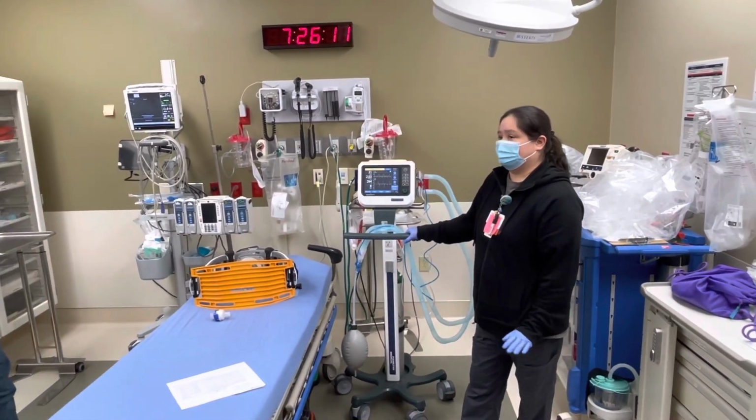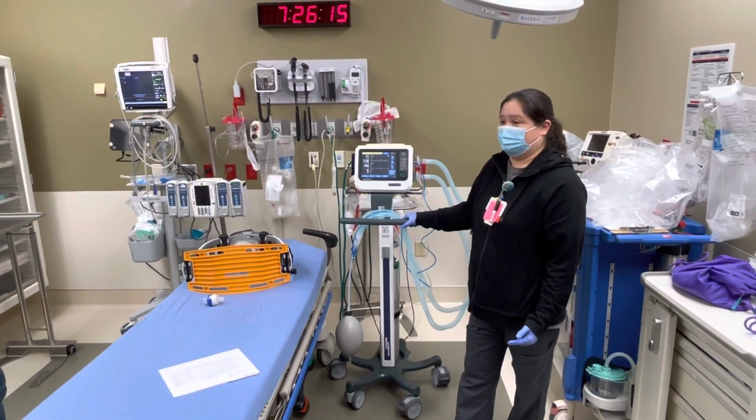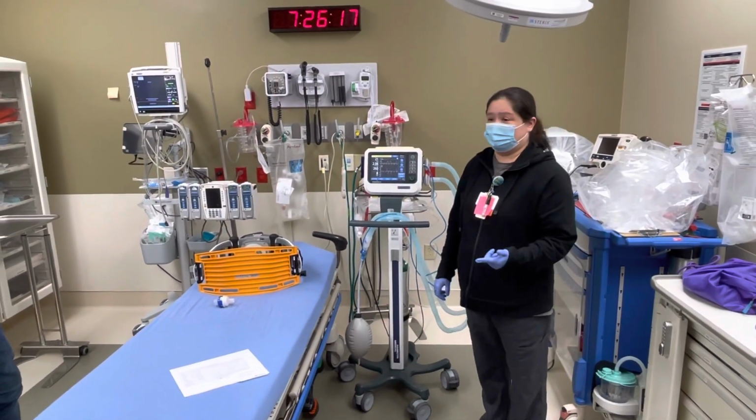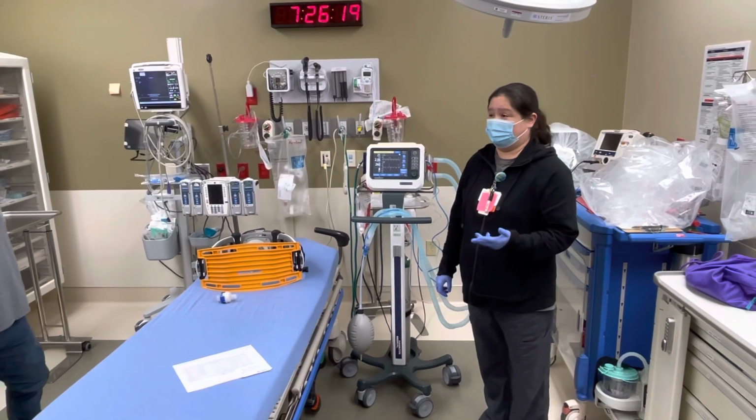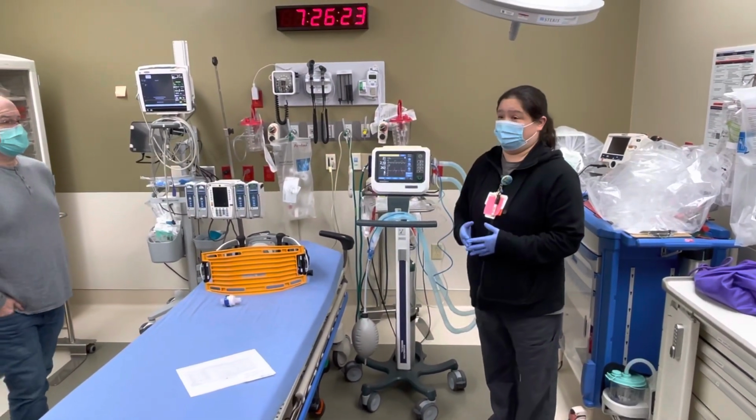Yeah, the thing is though, putting them on the vent is everything I just said. It is setting the rate, setting the appropriate tidal volume, setting the PEEP, setting the FiO2 and the I time and the flow. That is putting the patient on the vent.